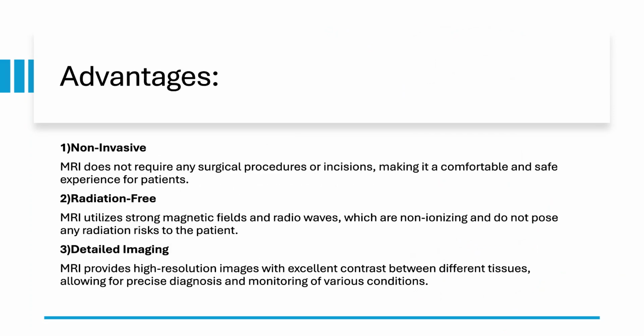Now let us see some advantages of MRI. Number one, it is non-invasive. MRI does not require any surgical procedure or incision, making it a comfortable and safe experience for patient. Number two, it is radiation free. MRI utilizes strong magnetic field and radio waves which are non-ionizing and do not pose any radiation risk to the patient. Number three, detailed imaging. MRI provides high resolution image with excellent contrast between tissues, allowing for precise diagnosis and monitoring of various conditions.